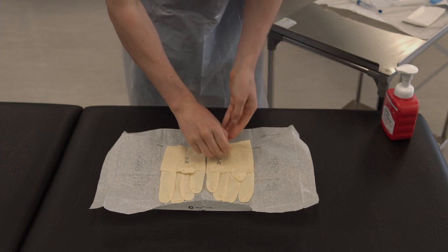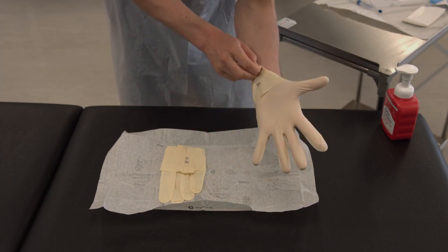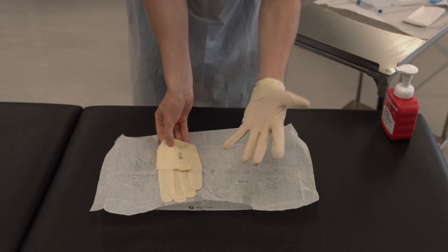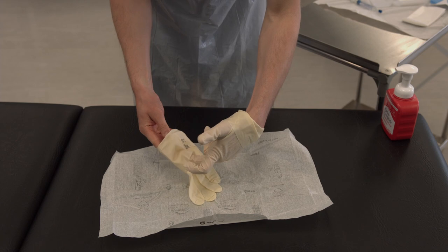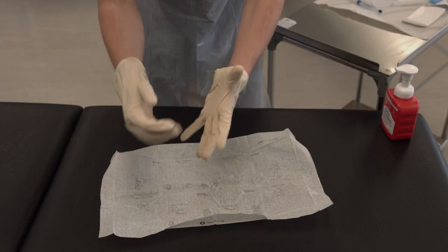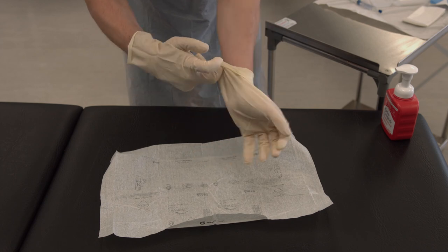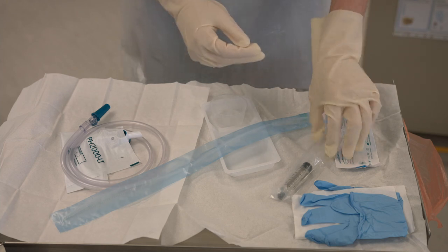Put on your sterile gloves using a sterile technique. You may now touch your sterile field.